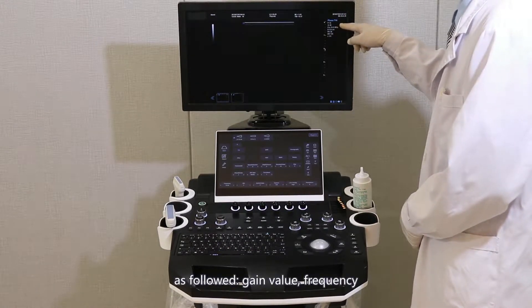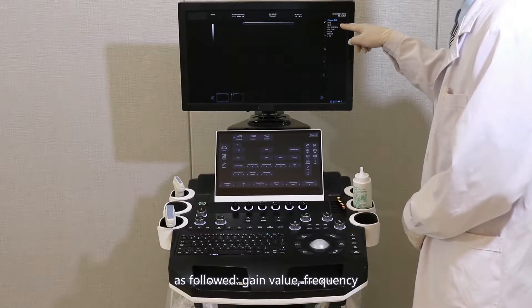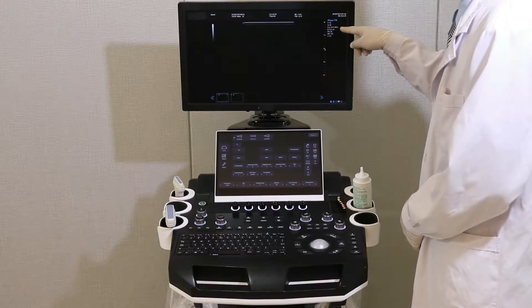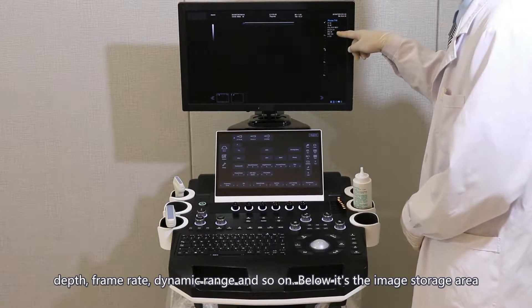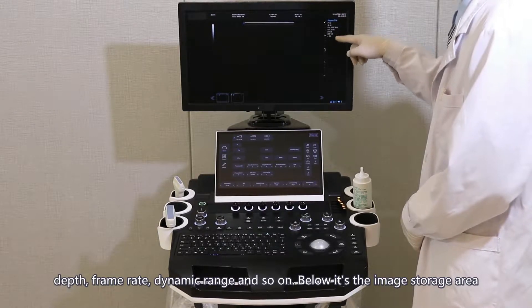The displayed parameters include gain value, frequency, depth, frame rate, dynamic range, and so on.